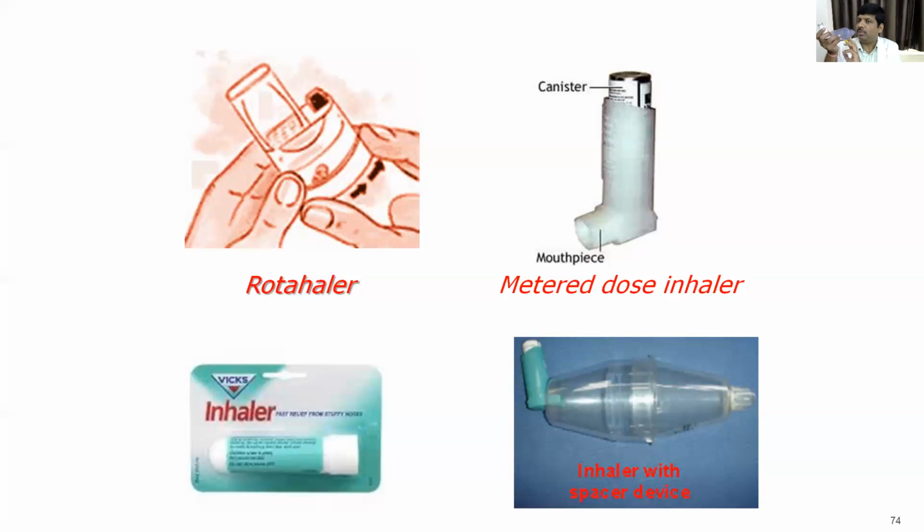You have to put it in the mouth, and there should not be any opening in between the mouth and the area of this. And then you have to just press this. The drug will come here, and then slowly, easily you can breathe and take it. Okay, there are flaps inside so that when you inhale or exhale, it will open and close. Okay, this is very helpful for the people who cannot take the drug easily or use it easily.